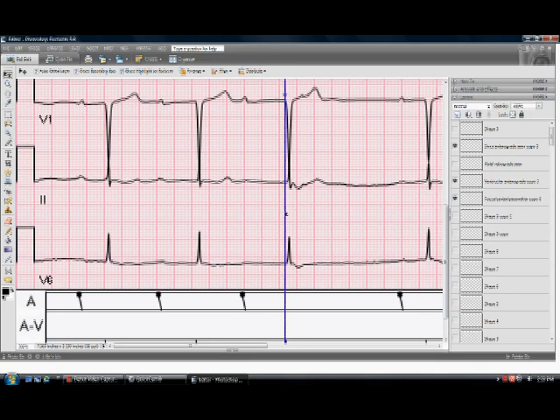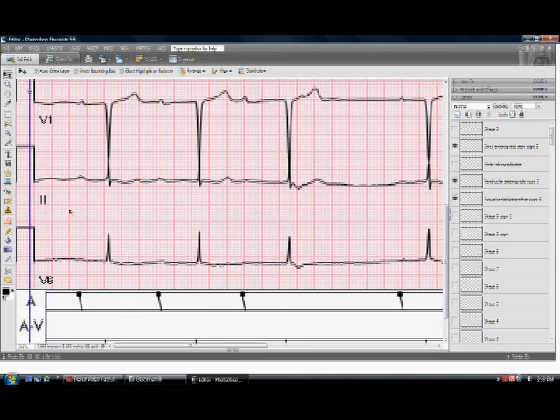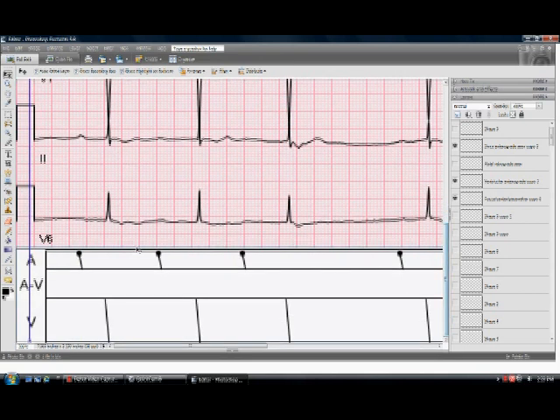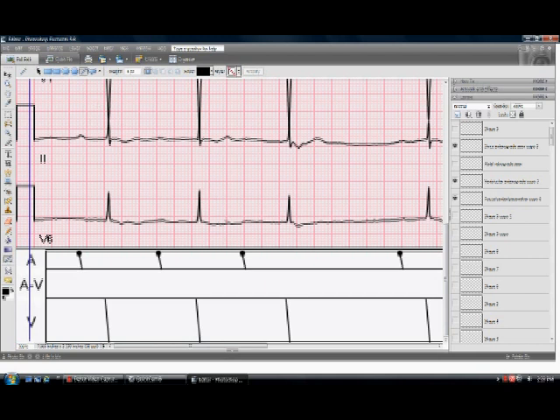At this point, I'd move the plumb line out of the way, off to the left margin. And selecting a black line with a weight of one pixel, I would put it here, stretch it from the atrial tier down to the ventricular tier, and simplify that layer.